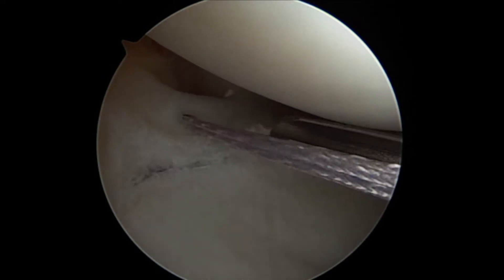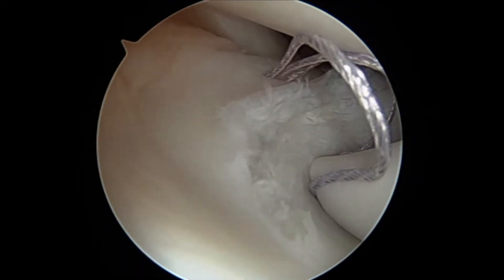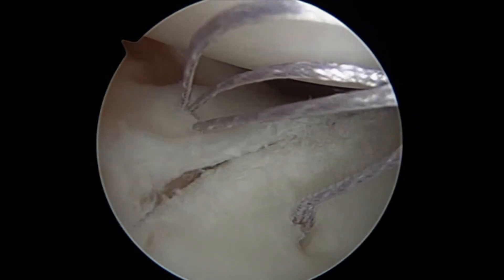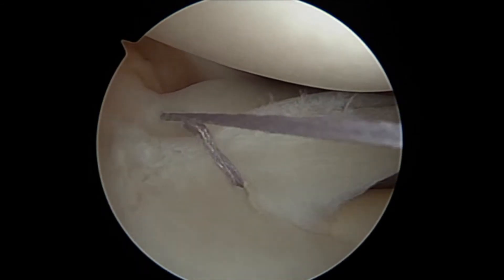Here you can see our meniscal repair device coming into position. Basically, what this allows us to do is place two small anchors on the periphery of the meniscus. Then the stitches between the two anchors can be cinched down to hold our repair securely until the meniscus tear can heal.